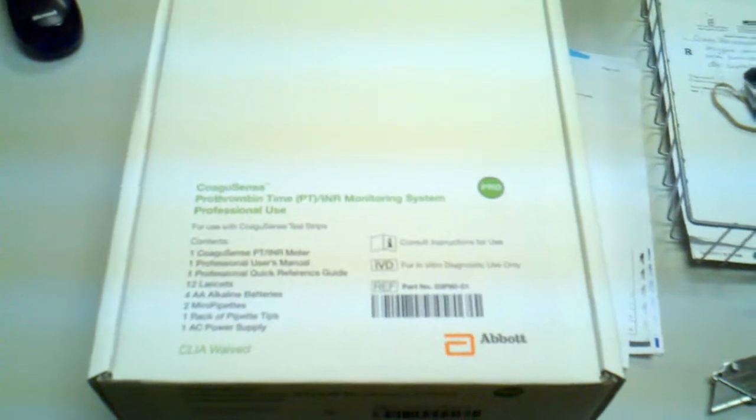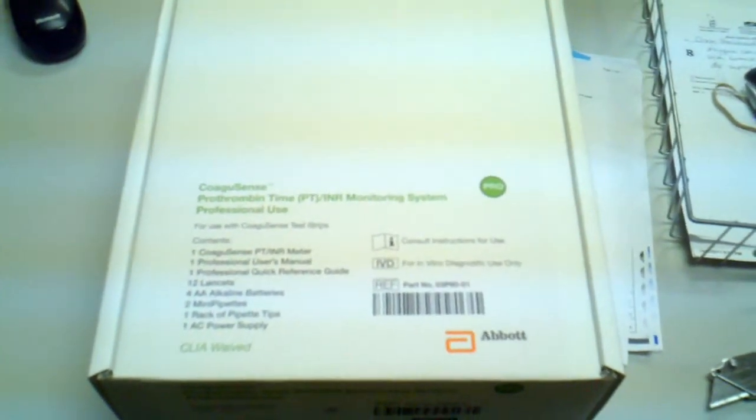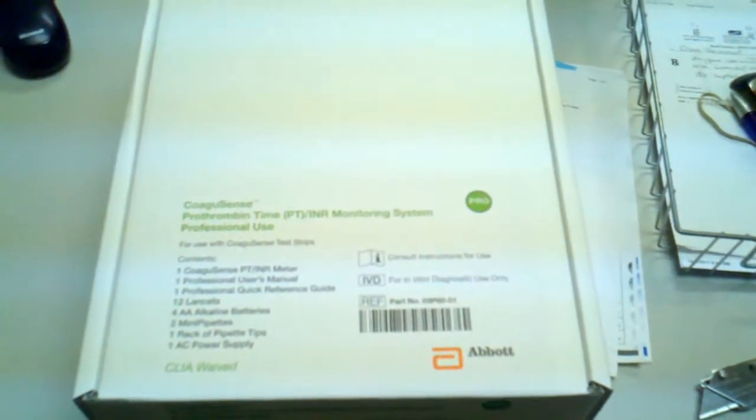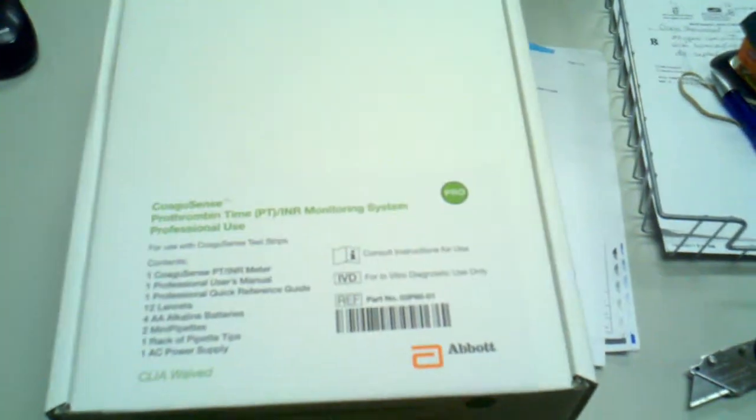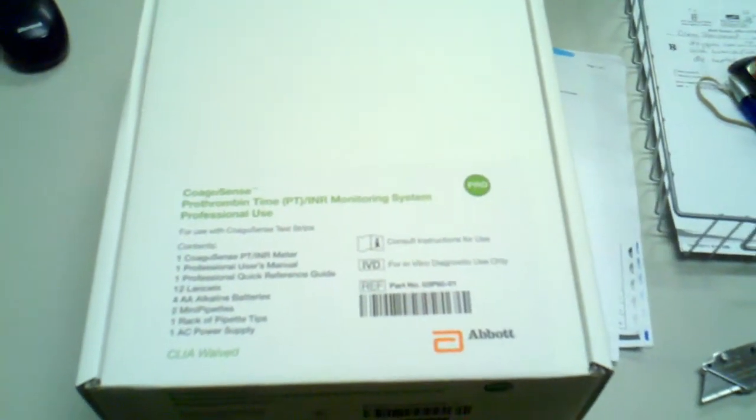This kit allows you the freedom to do whatever you want, whenever you want, and all you've got to do is take it out of the box and do your testing. This is pretty darn accurate. This is about as accurate of a machine as you're going to find.